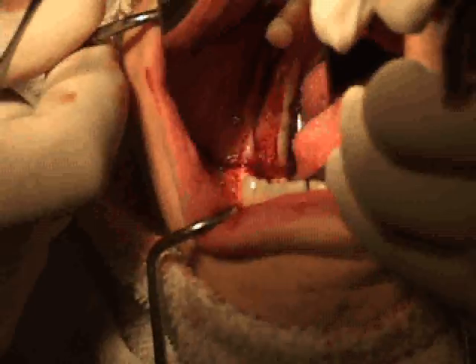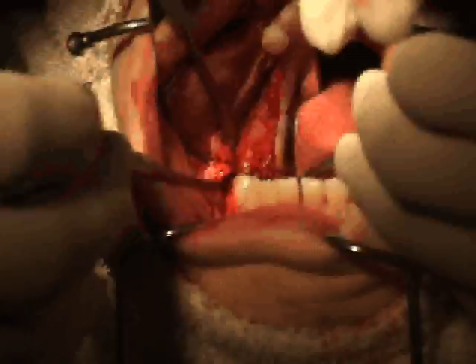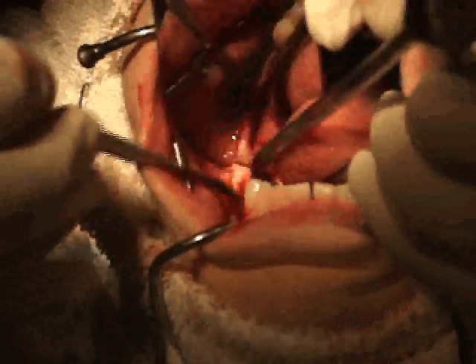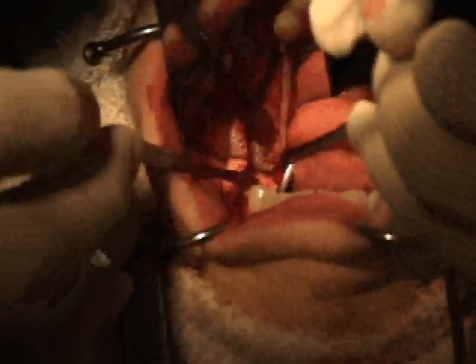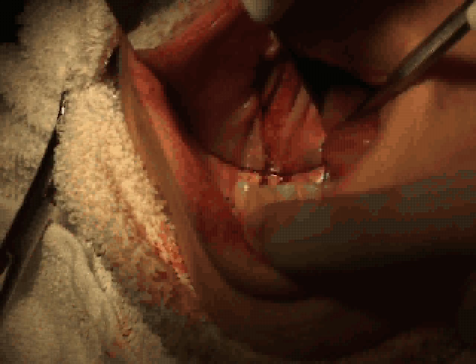You can see the progress of the reflection through the mirror. You can now see the top of the mandibular ridge. We still haven't gotten over the external oblique ridge. You can now see in the mirror reflection the external oblique ridge.